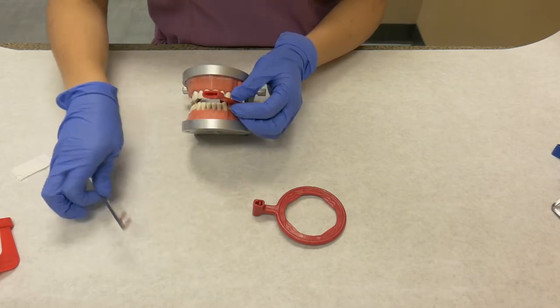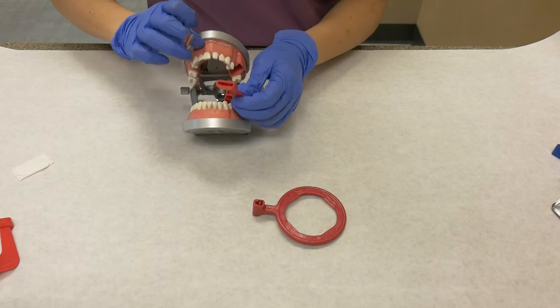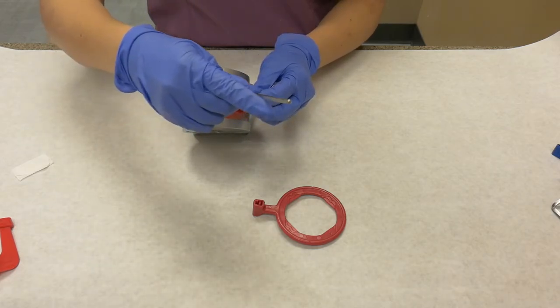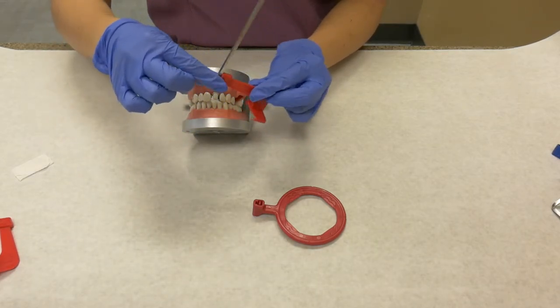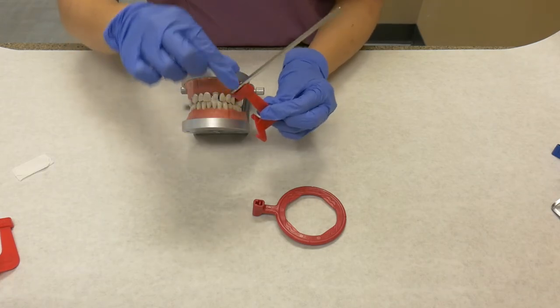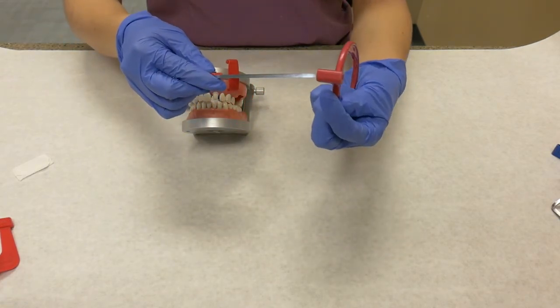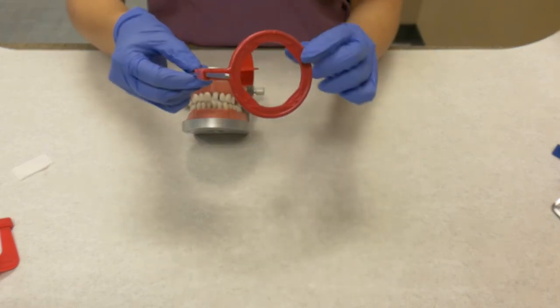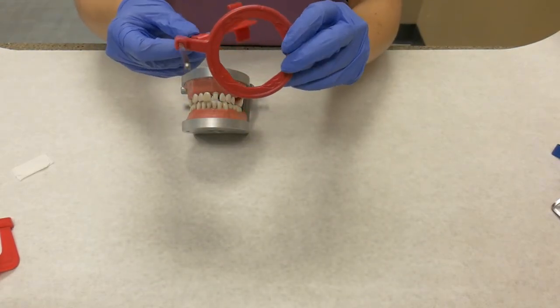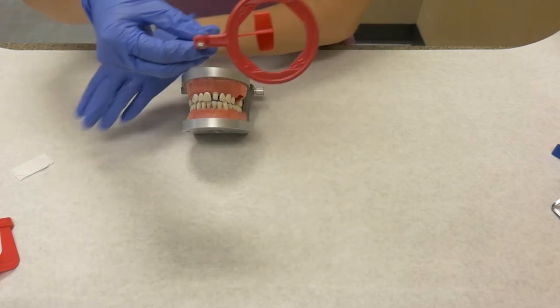So to set up our XCP, take the bite plate, keeping in mind how it will be placed in the patient's mouth, attach the bite plate to the metal arm, then slide the ring onto the other end of the metal arm so that the bite plate and receptor are visible through the ring.